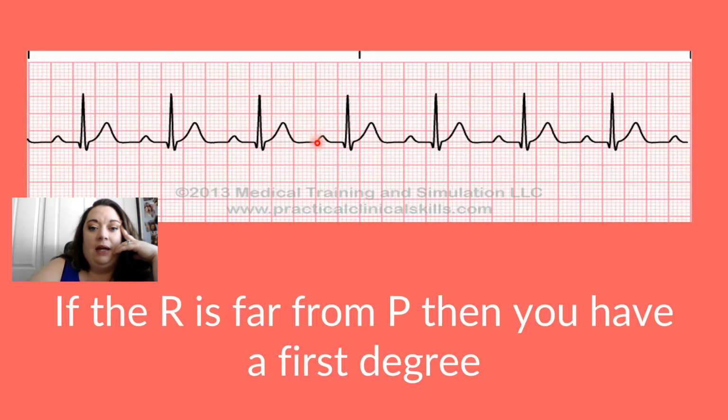If I look at, I'm going to measure this P wave, it starts on this dark line. And where should it not go past?